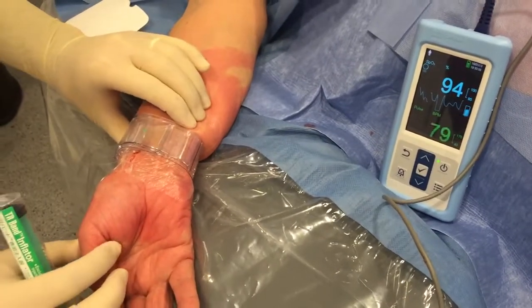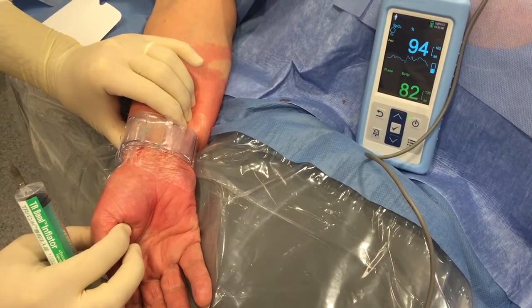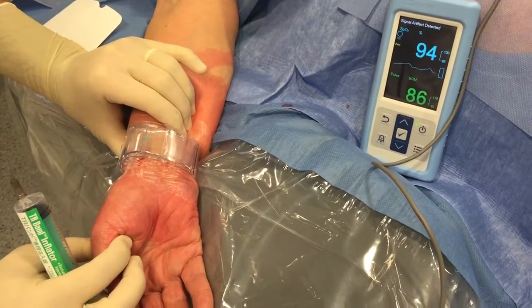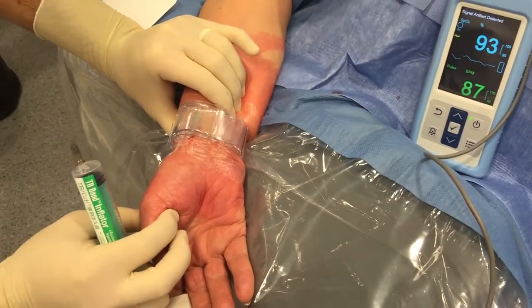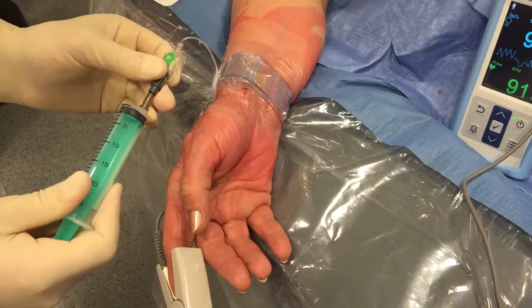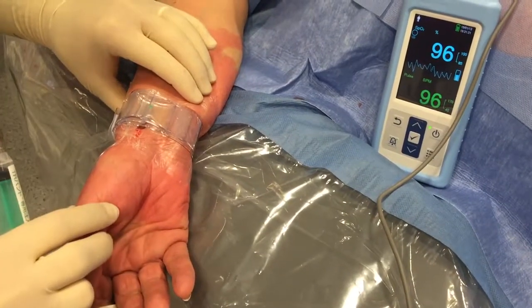Then we have to compress the ulnar artery, as you can see here. You see that we have a loss of the arterial pulse, or at least a flattening of the curve, which means that the compression is occlusive. So what we have to do now is to remove 2cc of air from the TR band, and we are going to check again if the compression is occlusive at the level of the radial artery.